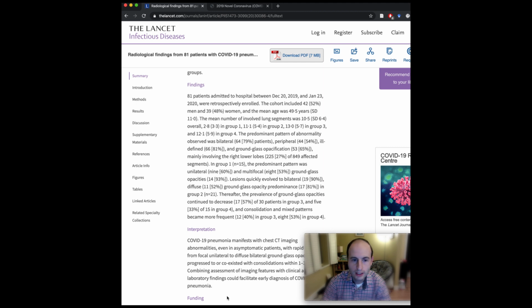Now, that's not to say that if you do see, even in a patient where it's unsuspected, a patient coming into the ER with chest pain, or alcohol withdrawal, or some other cause, and the imaging appearance is typical, it's certainly worthwhile at least discussing with your referring physician, making sure that they're aware this is a possibility. Whether or not you should actually put it in your report depends a lot on what the clinical team is thinking and what the probability is.